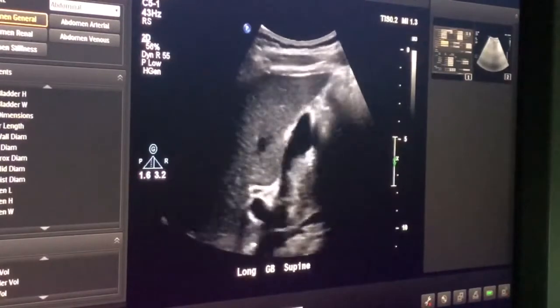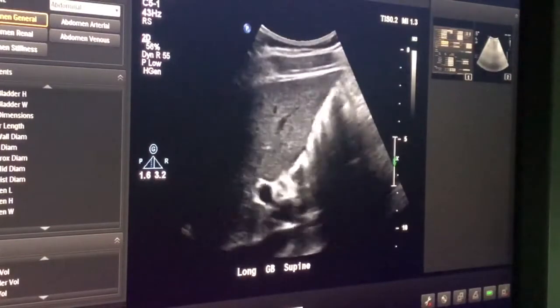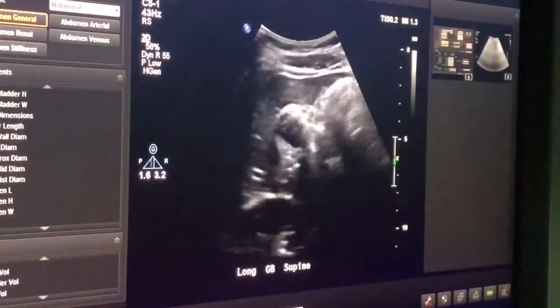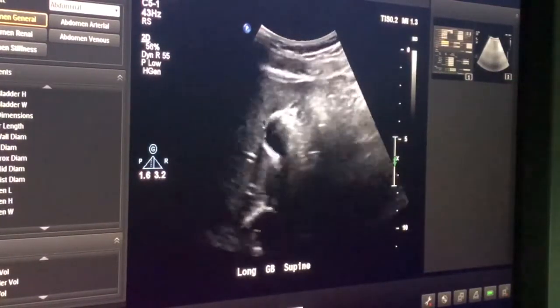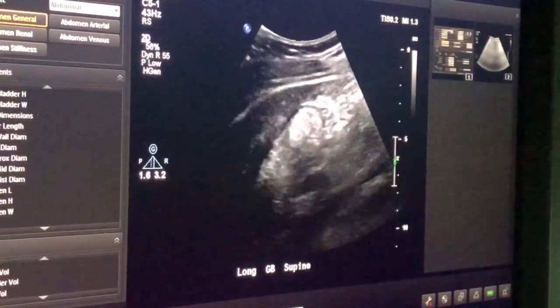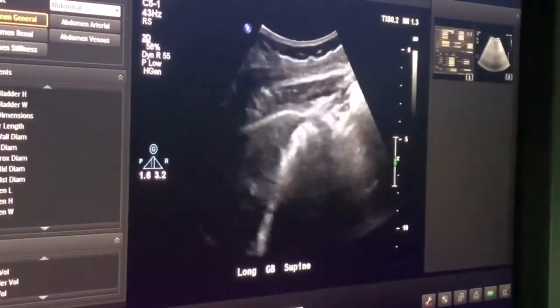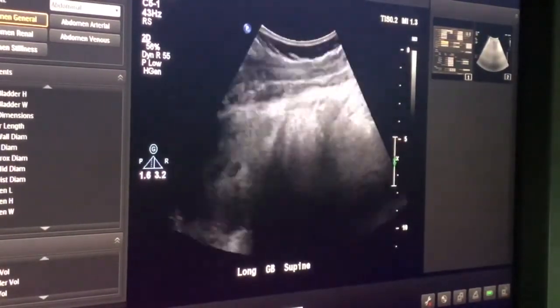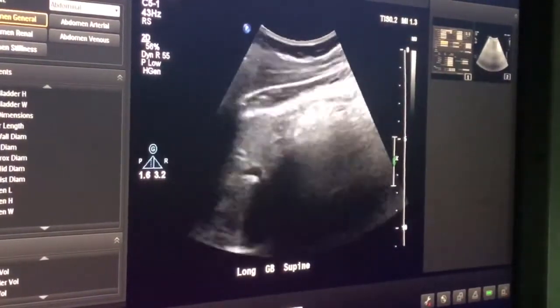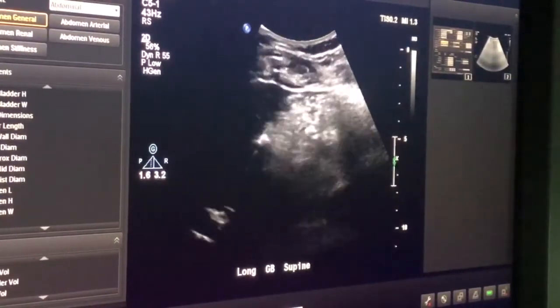So I'm starting at midline and seeing how it looks. I'm looking in the long axis, and then I'm going to look in transverse. Sweeping from fundus to neck. Okay, patient, breathe. And I was checking to make sure I didn't see any pathology that I may need to address during the exam, and also checking to see what windows work. On this patient, I was midline and slightly subcostal. I'm going to use that window, but if you're having trouble, you could always use a more intercostal window too.